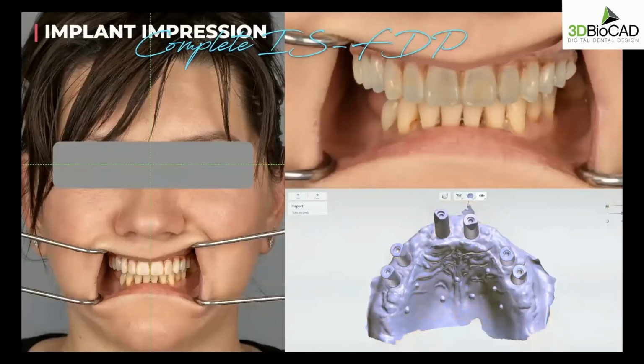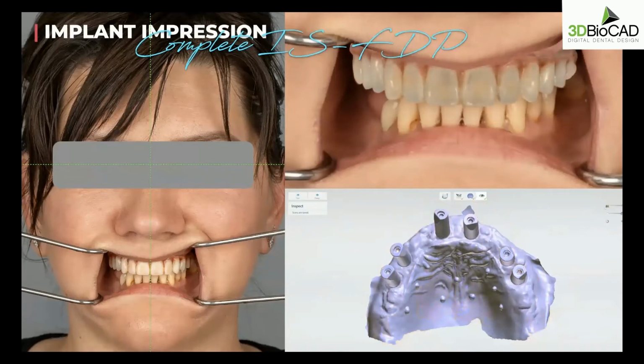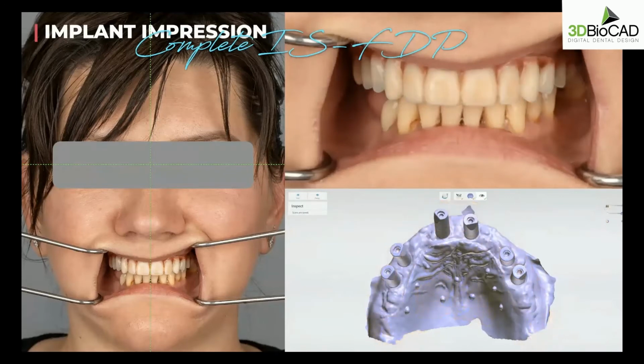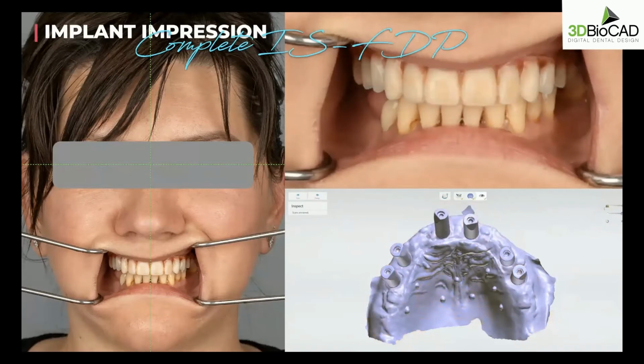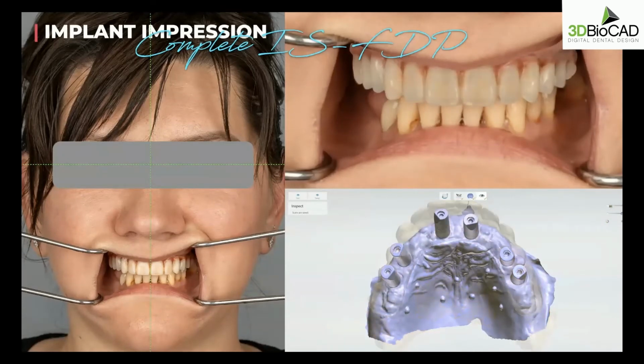And of course, there is other information that we need to send to the lab too. So just like the previous case, we need to send the full face photo so that the lab can do a digital face bow. If you look at the video on the upper right side, our lab has digitally mounted the upper scan to the face.